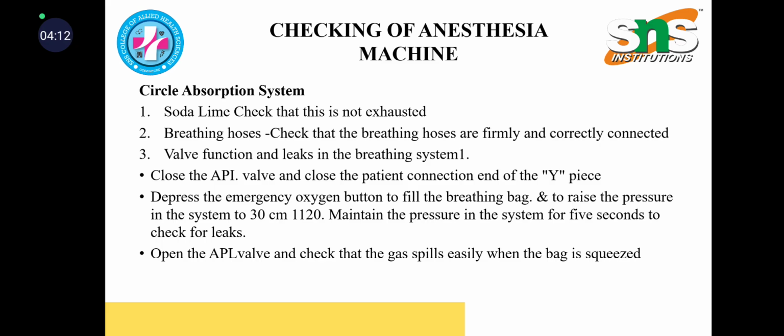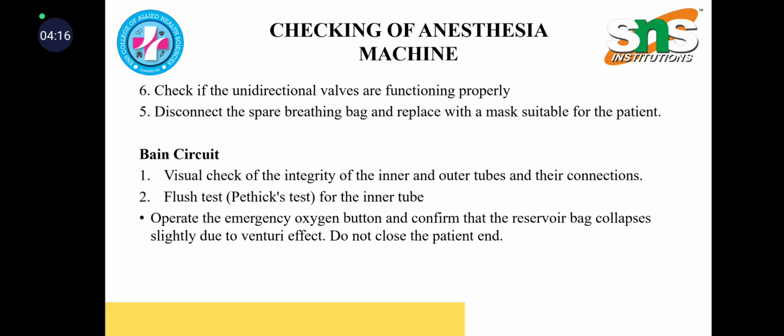Open the APL valve and check that the gas spills easily when the bag is squeezed. Check if the unidirectional valves are functioning properly. Disconnect the spare breathing bag and replace it with a mask suitable for the patient.